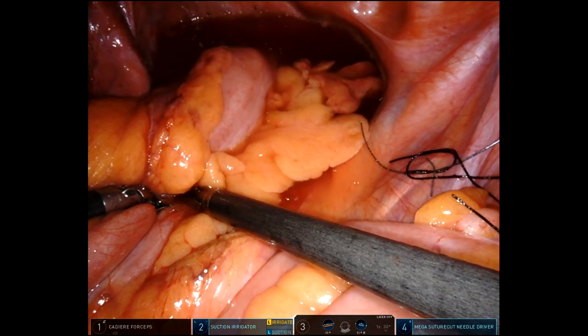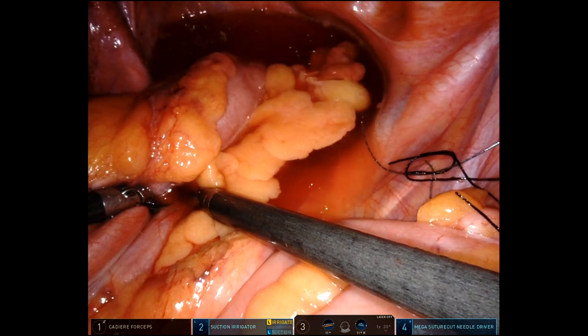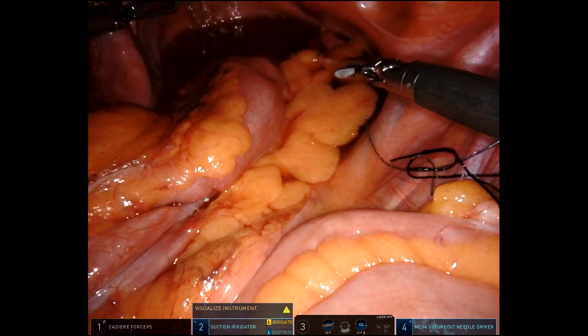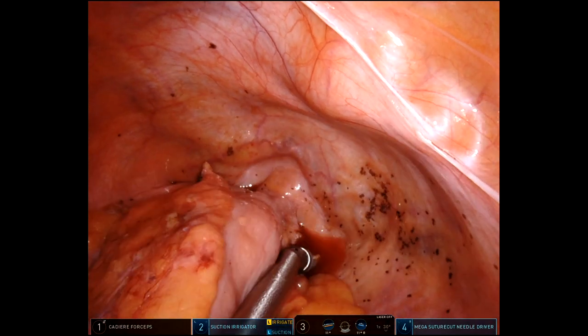I'm doing my leak test — driving my scope up and through that anastomosis. This is a 19-millimeter rigid sigmoidoscope: no bubbles, no bleeding, and wide open. No drain. After I undock laparoscopically, before I remove the trocars, I'll put some omentum in the pelvis. I hope you enjoyed. Bye-bye.